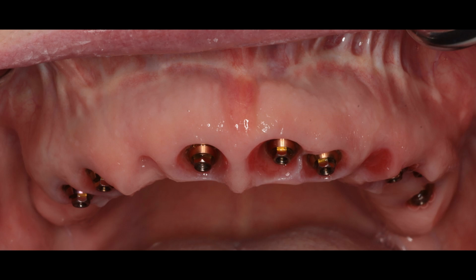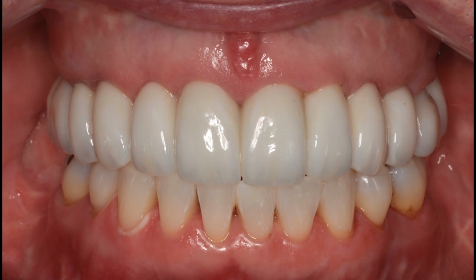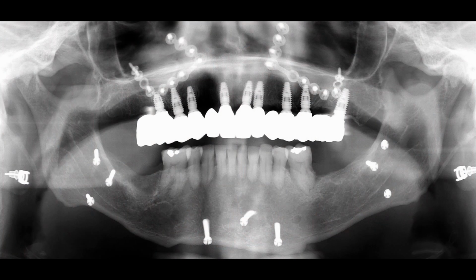Here are her final restorations. We did bleach her lower teeth, but if you look at these contours, it doesn't get much better than this. In fact, I might say it doesn't get better than that. There's her final pano. You can see we lost the one very back right implant. It was a bonus implant anyway, all the way back to her wisdom tooth, so not needed. We cantilevered a first molar, so she has 13 of her teeth, more on the upper than she even has on the lower.